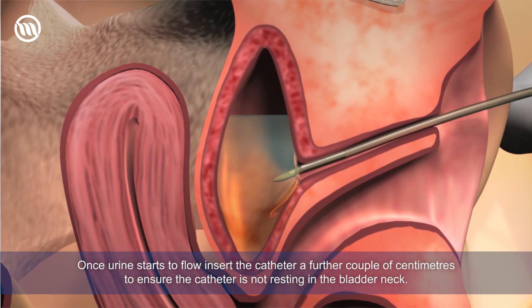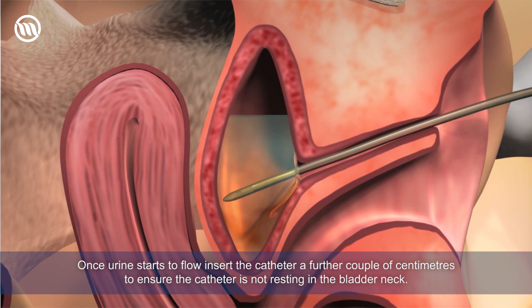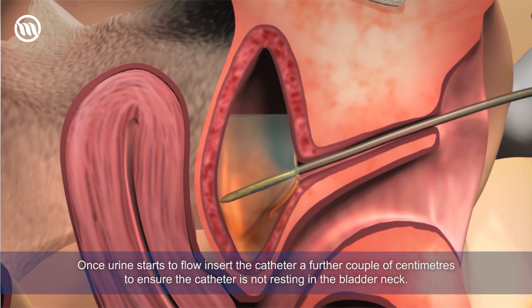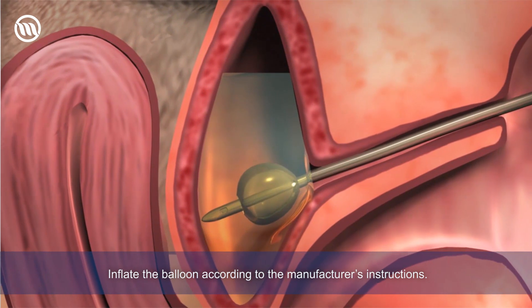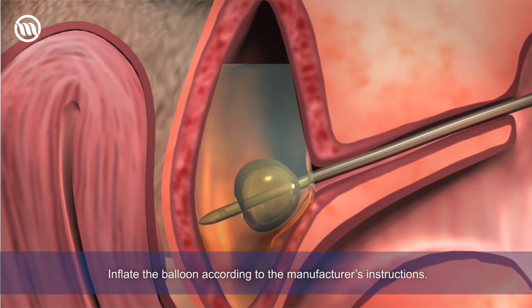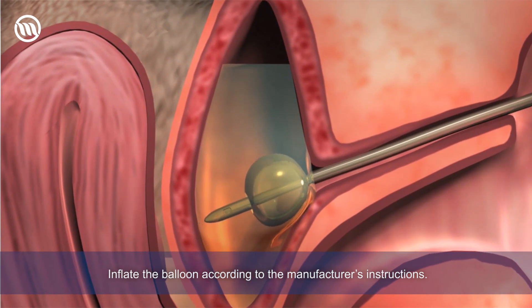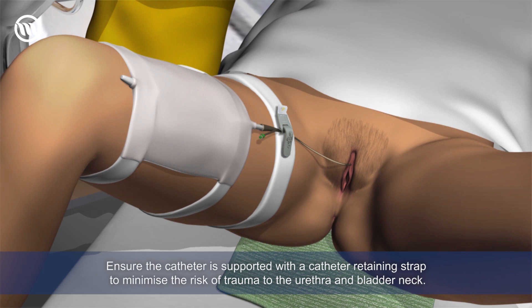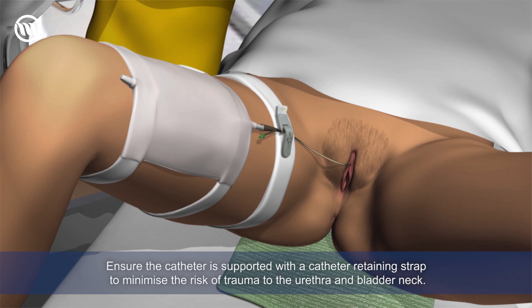Once urine starts to flow, insert the catheter a further couple of centimetres to ensure the catheter is not resting in the bladder neck. Inflate the balloon according to the manufacturer's instructions. Ensure the catheter is supported with a catheter-retaining strap to minimise the risk of trauma to the urethra and bladder neck.